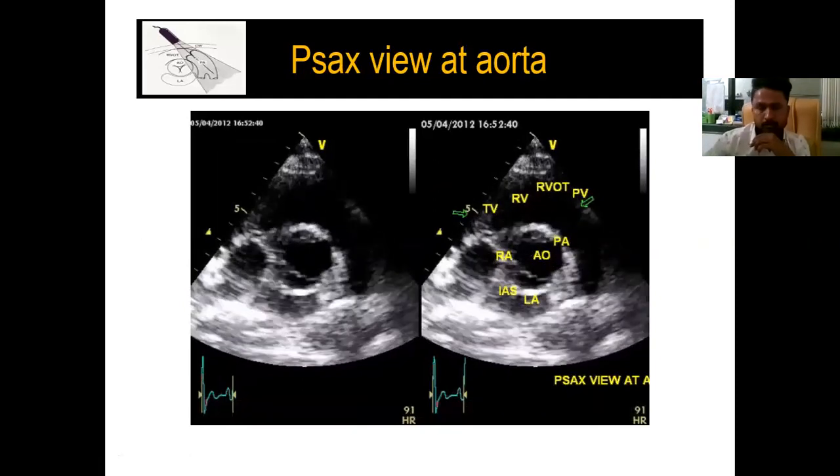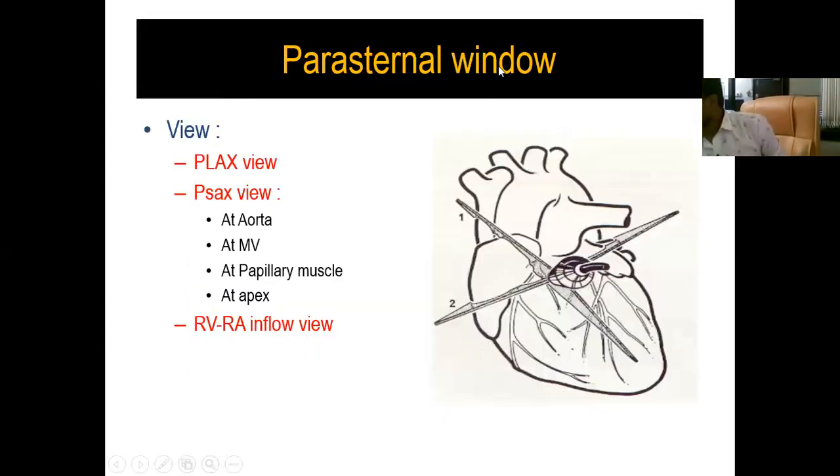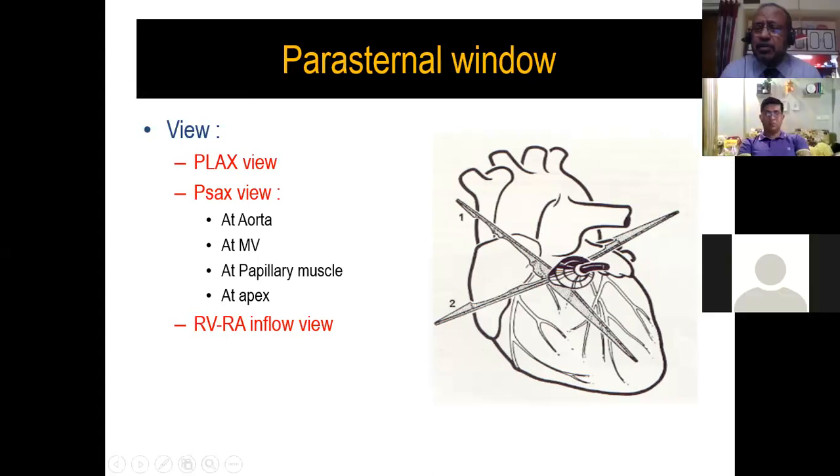Now, remember and go back to your old golden days of medical college. What were those golden days? We used to have a surface marking for echocardiography. What was the surface marking? Our teacher used to tell us, look, how do I look at my various subjects or various parts of my body?